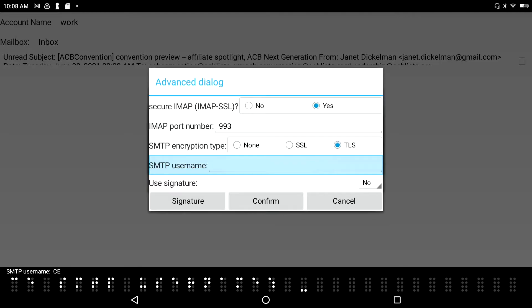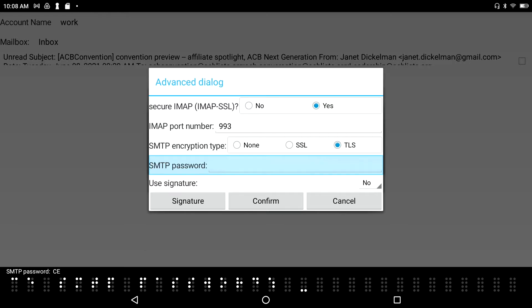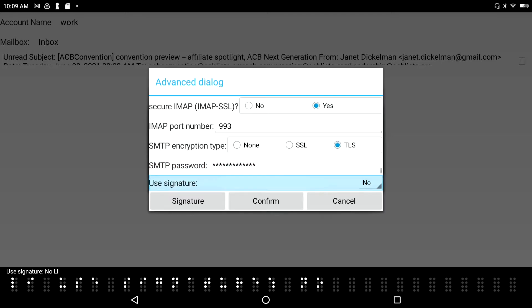I tab to the SMTP Username field and type my Gmail address again: harrisonearle@gmail.com. Then I enter my SMTP password. For the Use Signature option, I leave it set to No for now. That's fine.